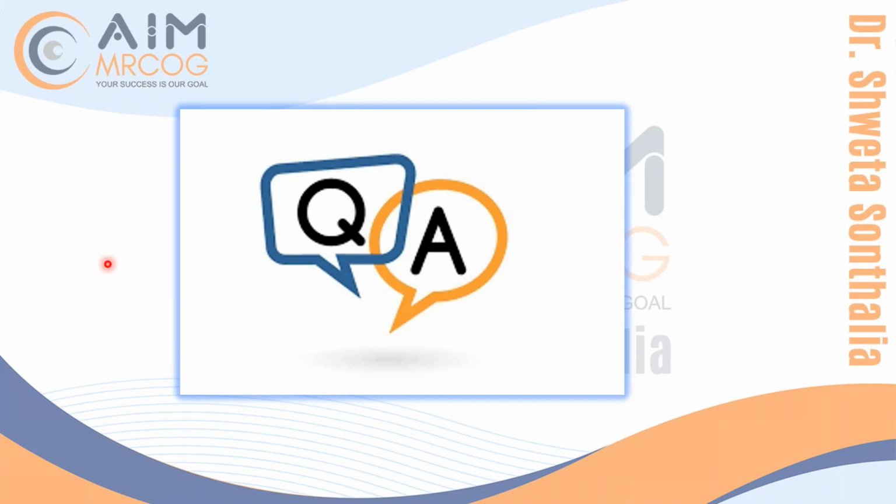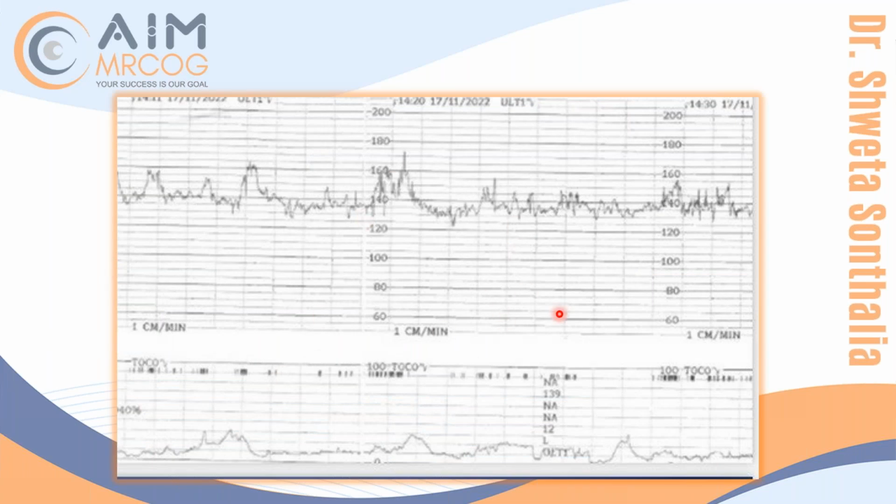So let's practice the questions. You all should know how a real CTG looks. If you see, here is the date, there is a time. Again, it is a cut piece, so you might miss some information. Otherwise, it also has ups and downs. Here is the toco probe, and here is the contraction recorded. If you see the speed, it is 1 centimeter per minute. This is the heartbeat. Now you tell me, who wants to read the CTG and tell me what you are gathering from this?